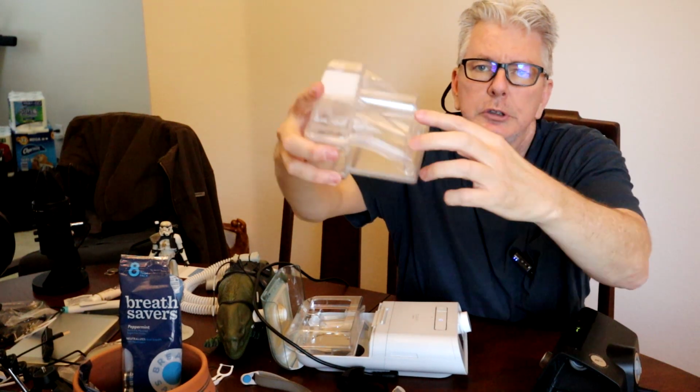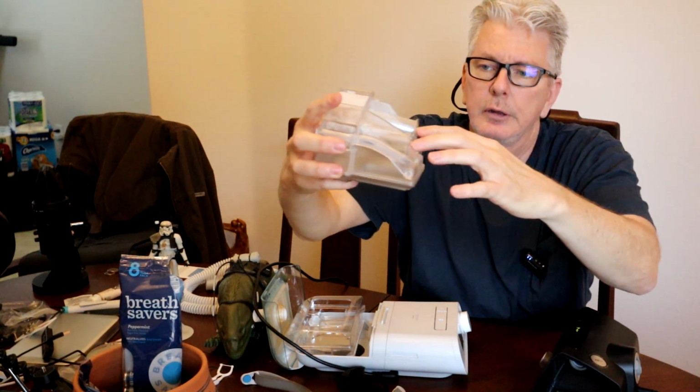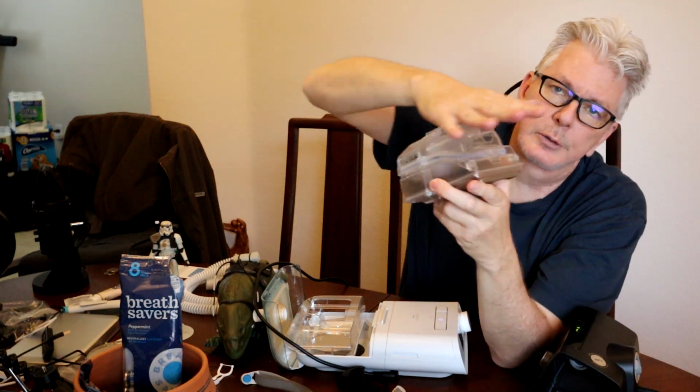And right here, there are two holes where the humid air comes out. The water is in here, and through these holes, the humid air comes out and into the machine and into your mask.